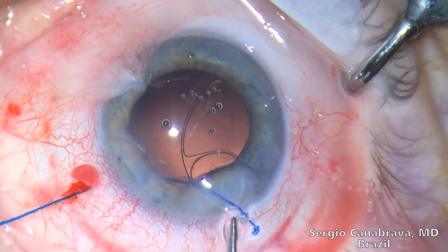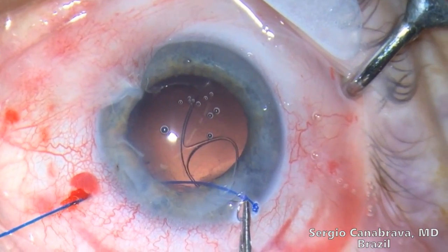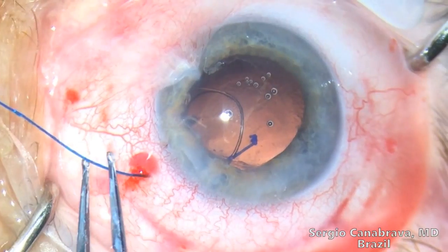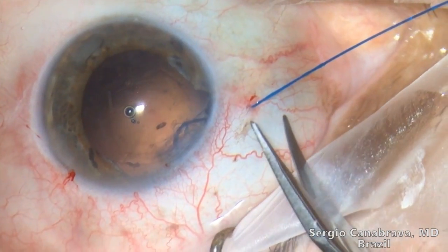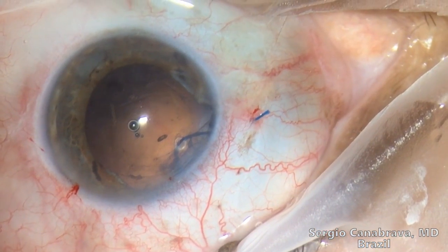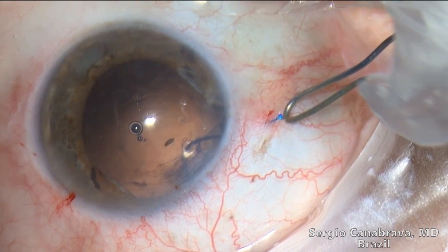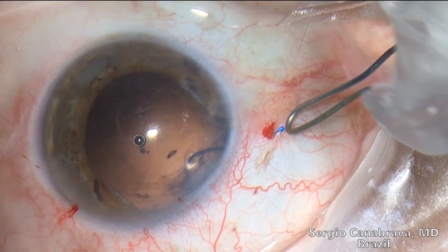Step 5: The CTS or the modified CTR is then placed in the same quadrant of the zonular weakness, as shown in this video. Step 6: Cut the 5-O monofilament to about 5 mm, then heat it and shape it into a flange. Finally, the second flange is then inserted into the sclera using a McPherson forceps.